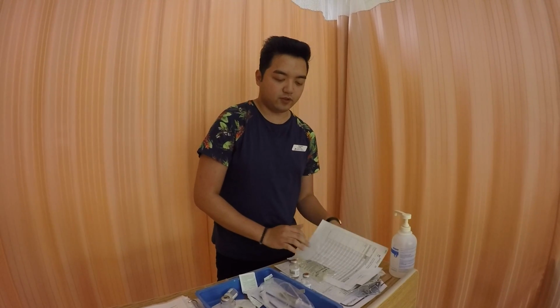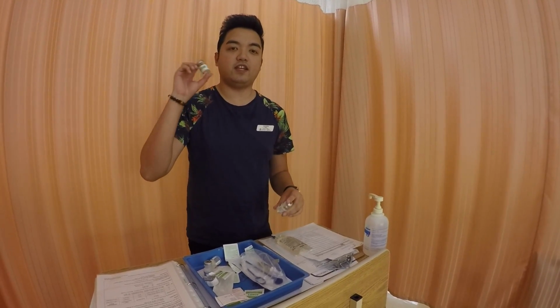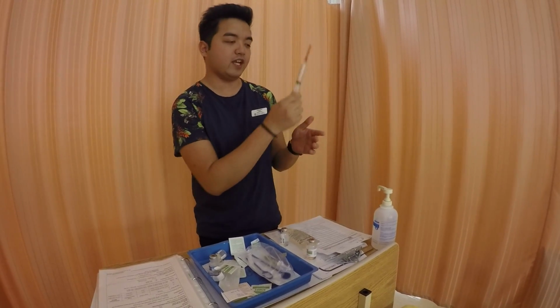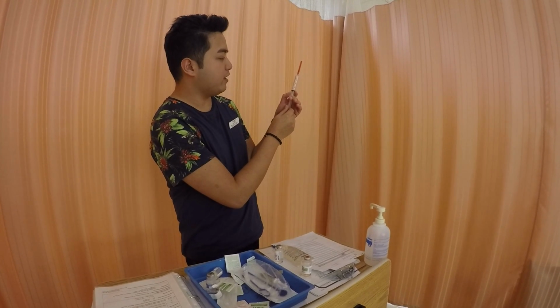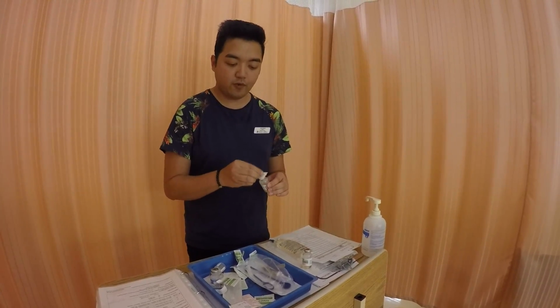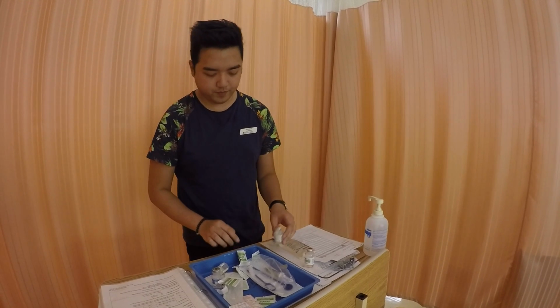Okay. So to get the accurate measurements, I'll first get the 10 ml from this vial and then the other 5.8 from the other vial, just to make sure that I have the accurate measurement. So using a 10 ml syringe, I first pull 10 ml of air and then swab the opening for 30 seconds, let it dry for 15. Oops.